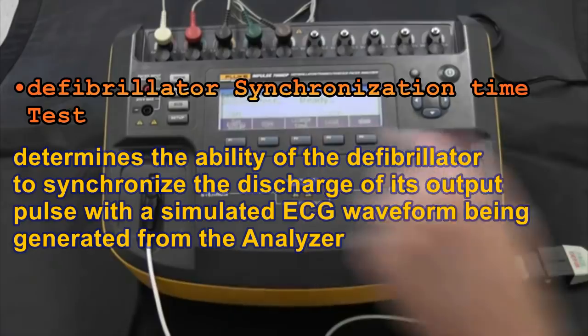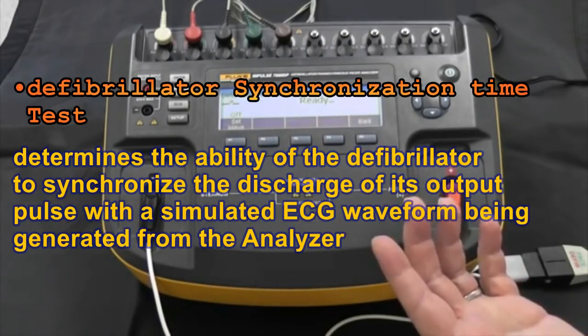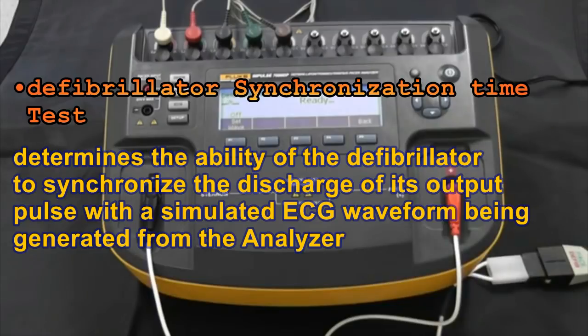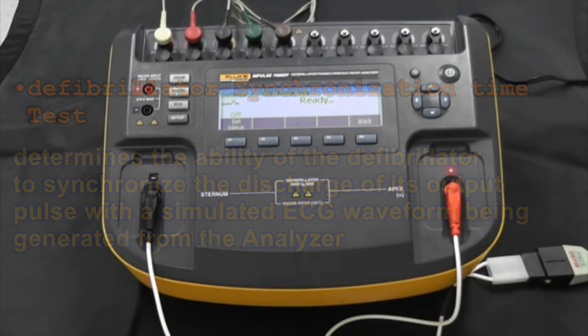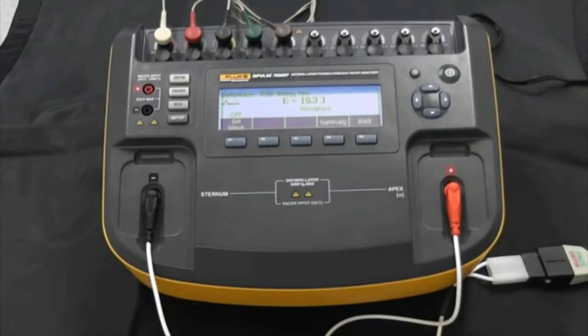Let's pick defib energy. The Impulse 7000 is actually ready to deliver energy right now, so we just charge up our defibrillator. We have 20 joules selected to deliver our energy. You can see that we immediately get not only the energy level displayed on screen but also the wave pattern. In this case it's monophasic. I did not have to tell the Impulse 7000 what to look for — it told me what it measured and what it saw based on the energy delivery. It tells you what it sees.